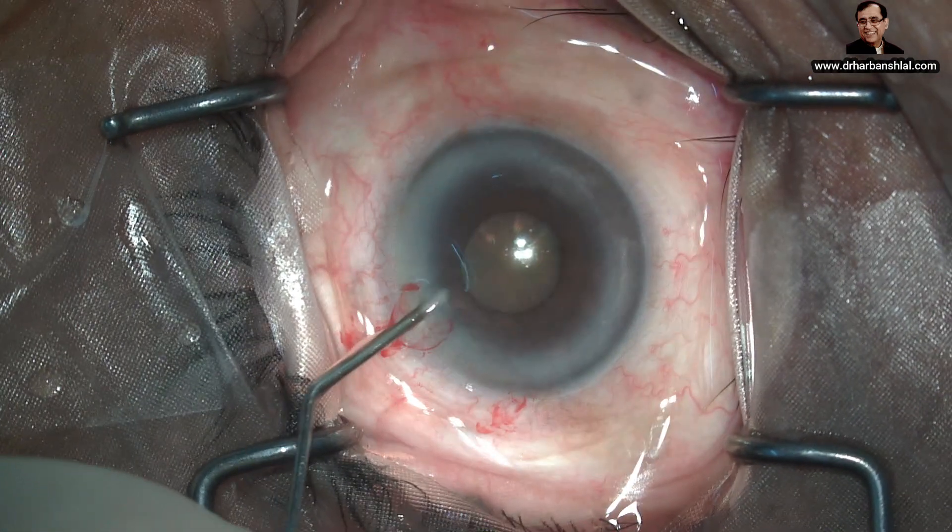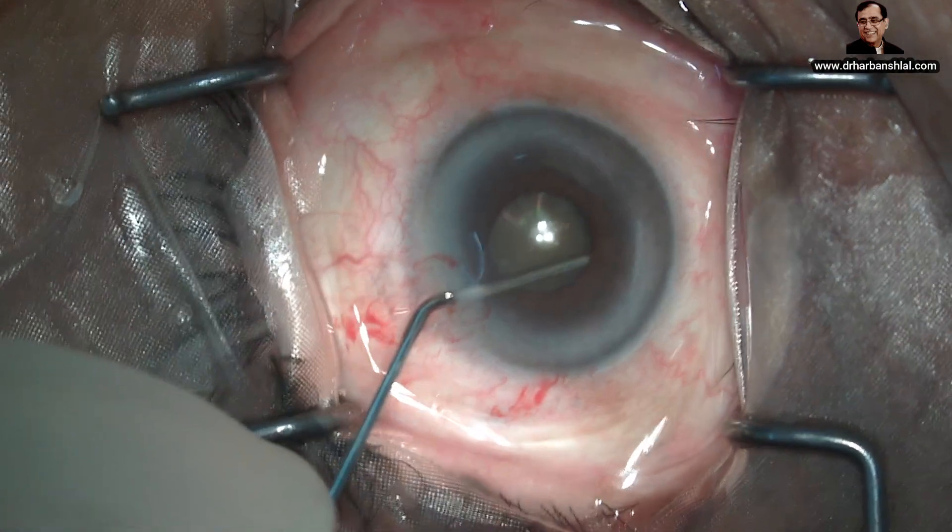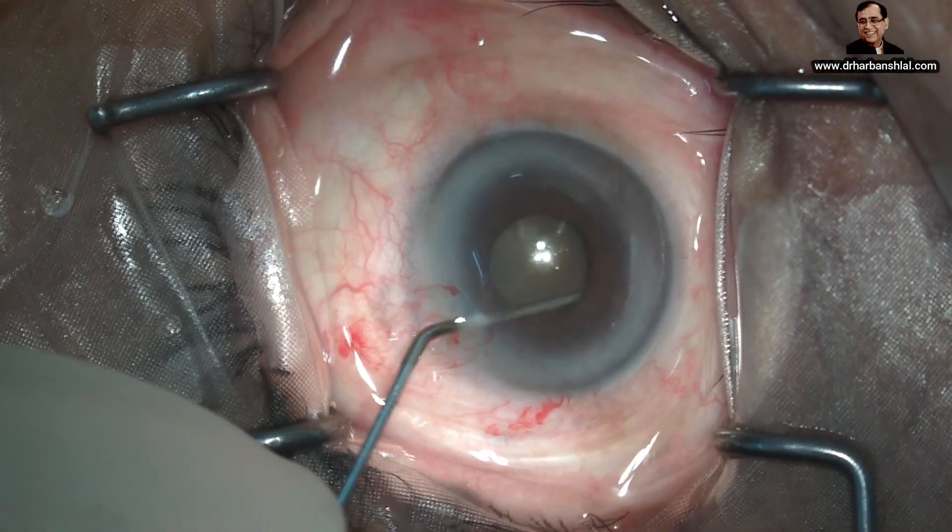If you put viscoelastic on top of the iris, it will compress it against the anterior capsule and pushing the scroll will be difficult.